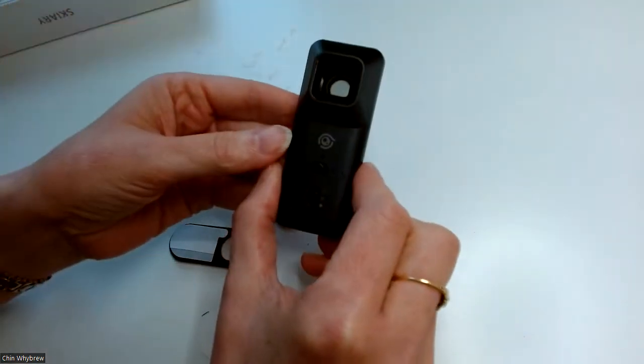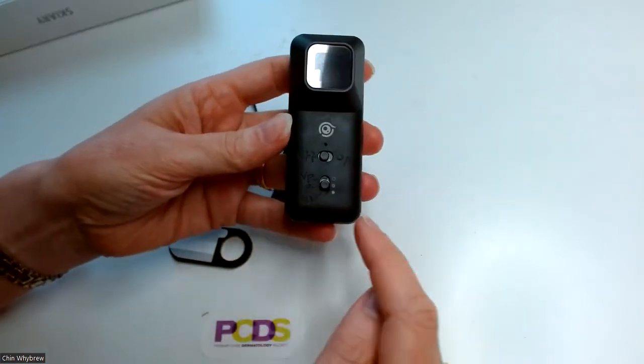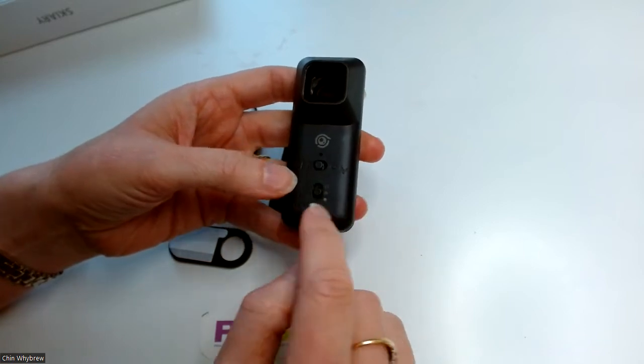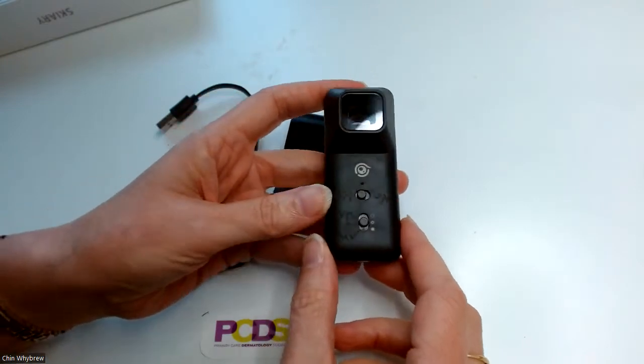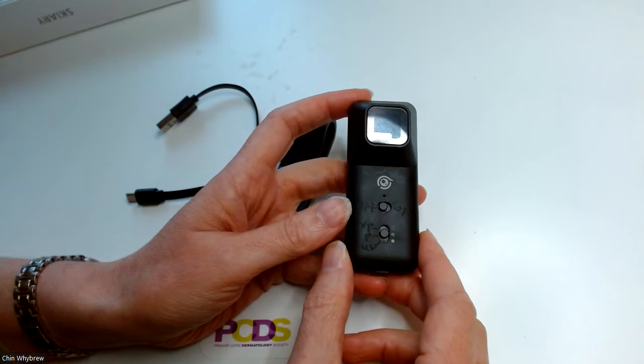First of all, this is the scope. What you can see on this one is I've actually etched on a few extra things because the on-off button and the changing mode buttons are not terribly easy to see. So I'll try and line it up there so you can just about see what it looked like beforehand.